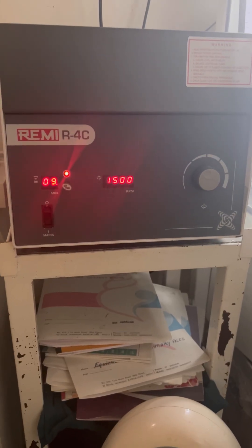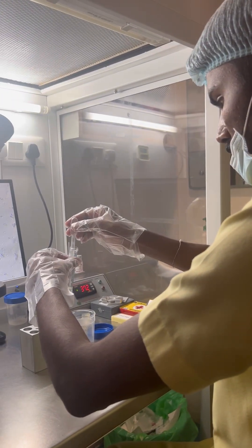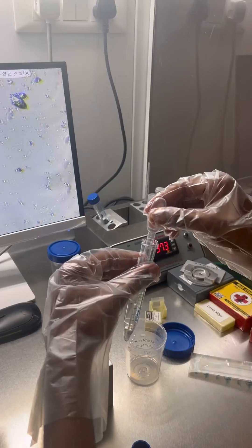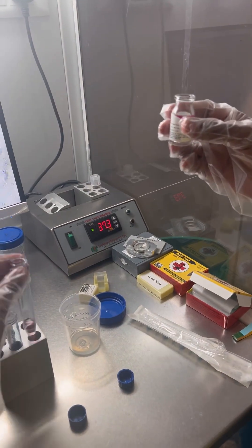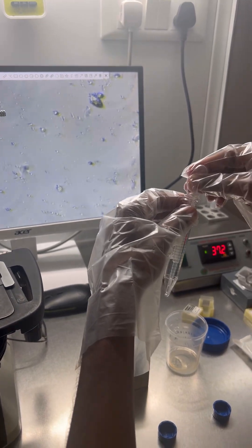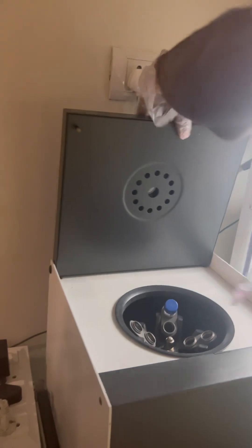We place the test tube on the centrifuge for 10 minutes at 1500 rpm. Once done, we take it out and remove the supernatant — the upper fluid which contains debris. This is the washing media stage.